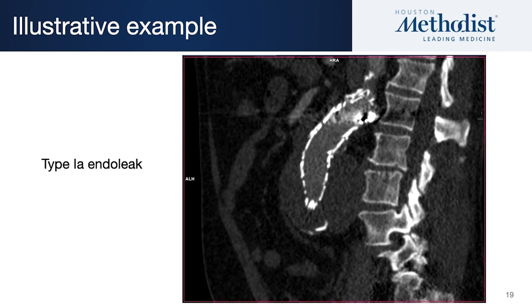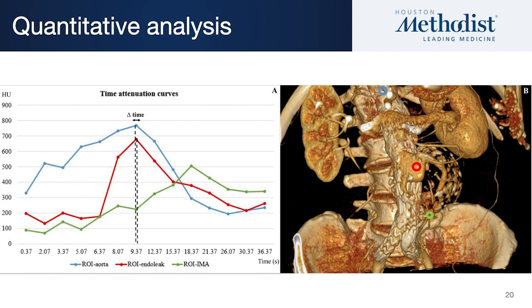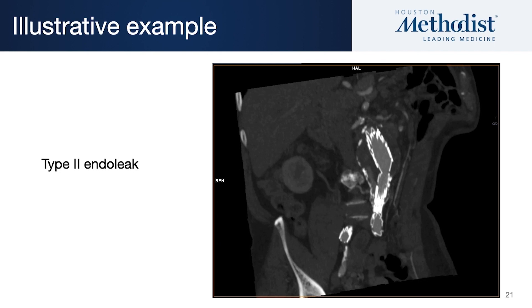Here's a type 1 endoleak, for example. You can see dye arrives in the aorta and dye arrives in the aneurysm sac almost simultaneously — pretty likely it's a type 1 endoleak. You can confirm this by quantitating it. You can see that the red area where the dye was arriving in the aneurysm sac was the same time as it comes down through the endograft. It's confirmed by the anatomical imaging. As a control, you can choose one of the lumbar arteries and you can see the time curves are shifted.